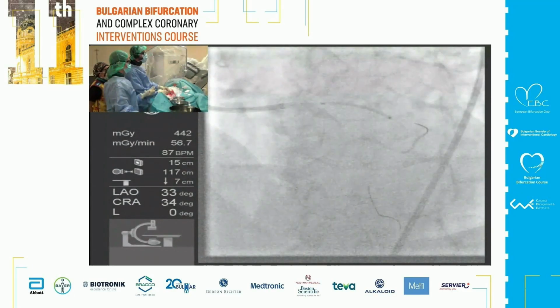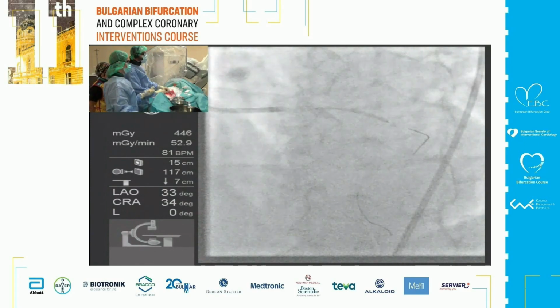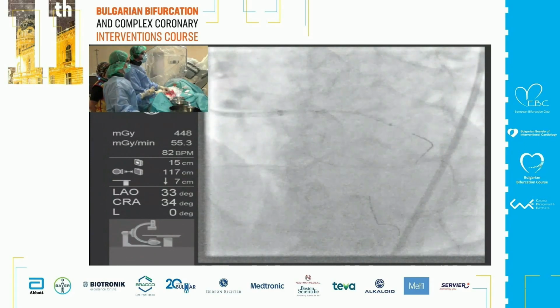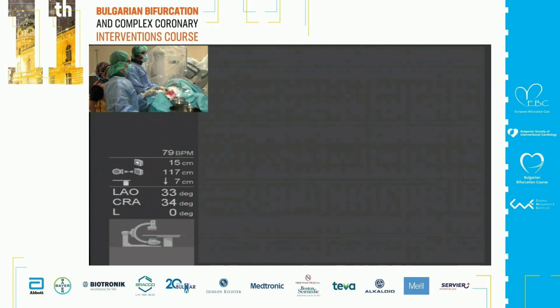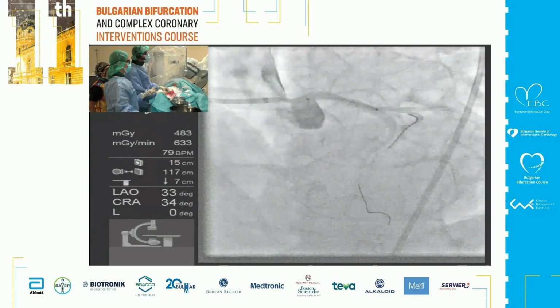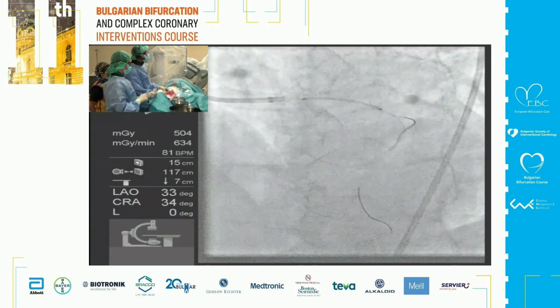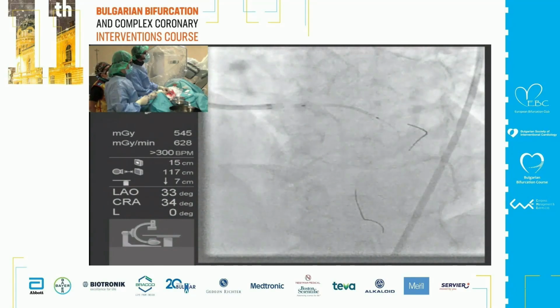Because we know now, since the last EBC, maybe the previous one, that stents surprisingly are elongating. Okay, say that again. Stents are elongating when you inflate them. That's curious. That was by a guy from Hungary.